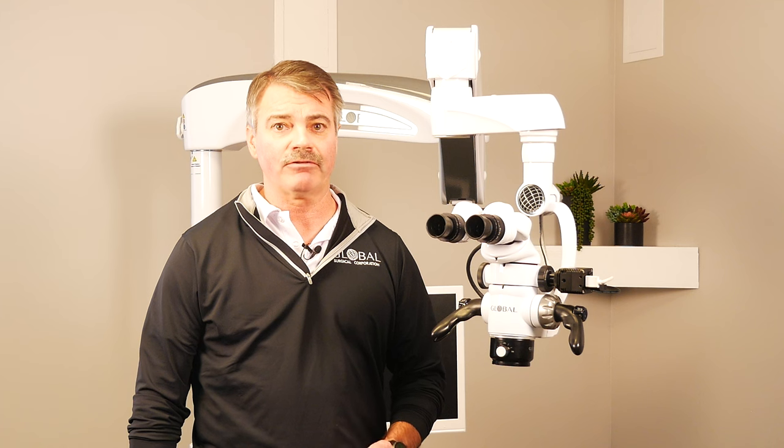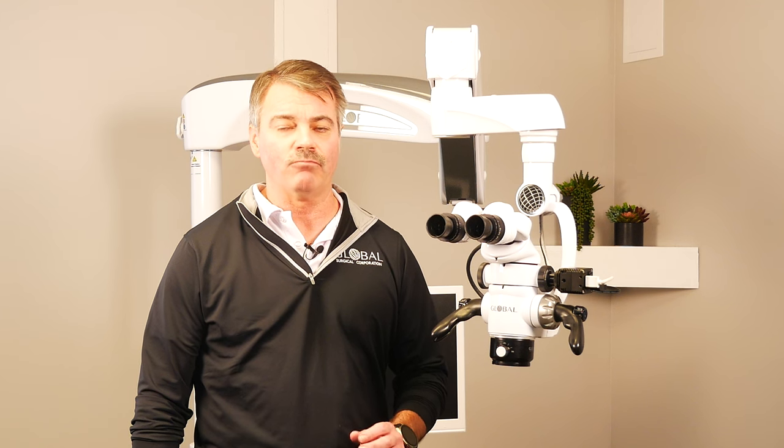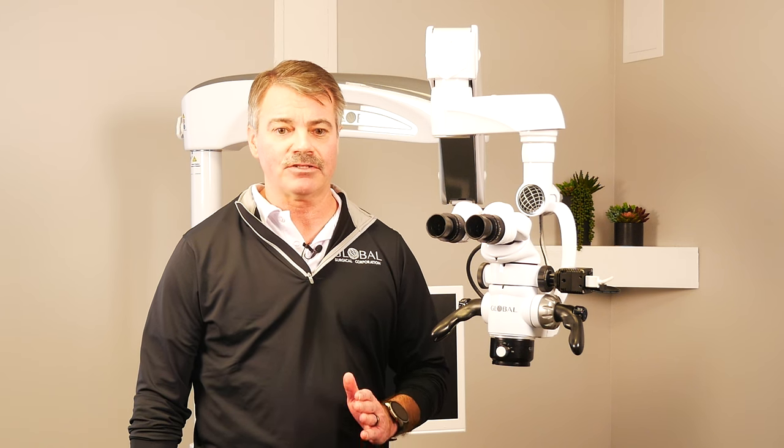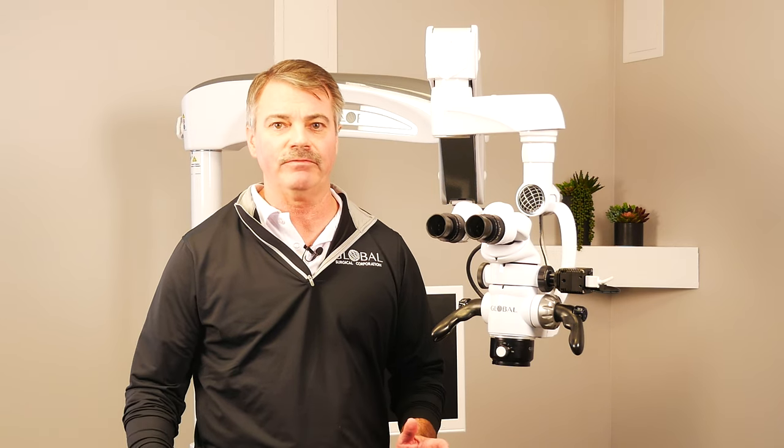Using the microscope, not only is it very bright and well illuminated, but the light follows the same path as your vision, so there's shadow-free vision inside the patient's mouth.